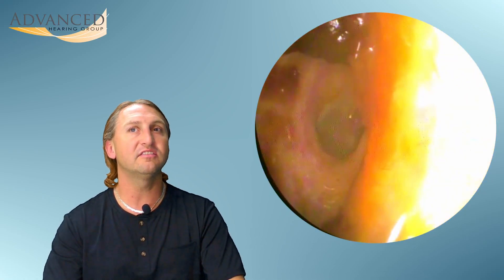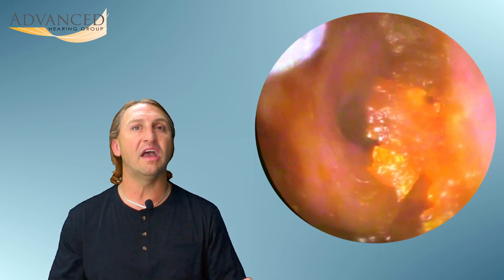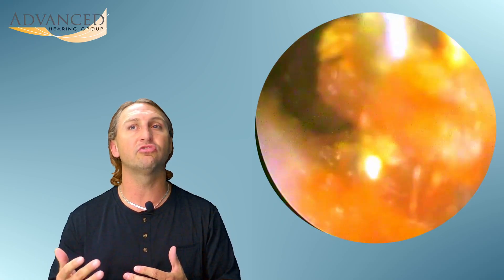Now we're going back in. This is the patient's other ear, not nearly as packed up. All we're going to do here is just a little cleanup. Since we did one side, we might as well do them both. It's really important that when you're having your hearing tested, they make sure they get all of the earwax out, especially if they're going to be doing tests like a tympanogram and making sure the eardrum is moving properly.